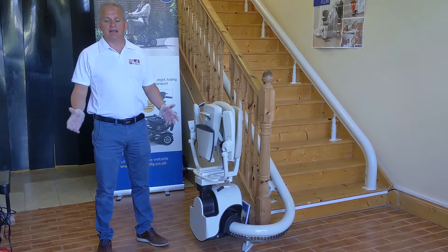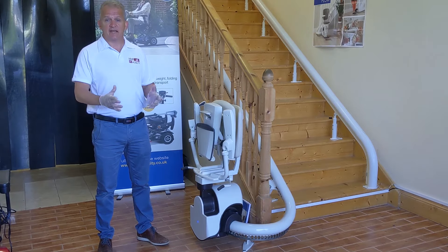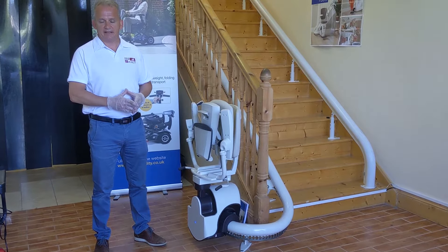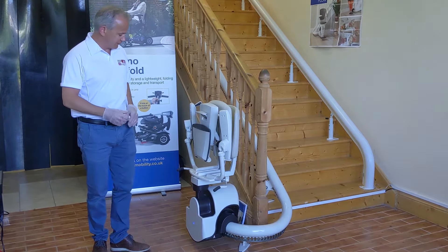Hi, I'm Ciaran from ISB Mobility. I'm here today to show you and demonstrate the Flow 2 curved stairlift. It's been very popular for many years, always updated its technology, and is made by ThyssenKrupp — a very big brand. So let's get straight into it.